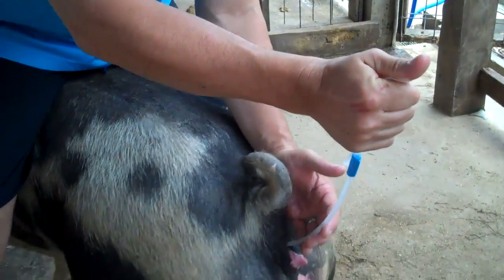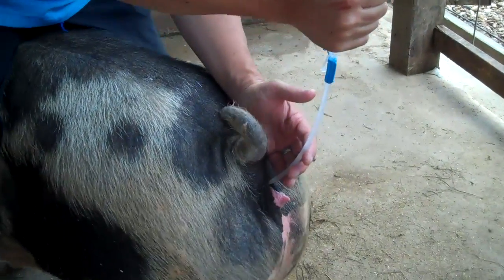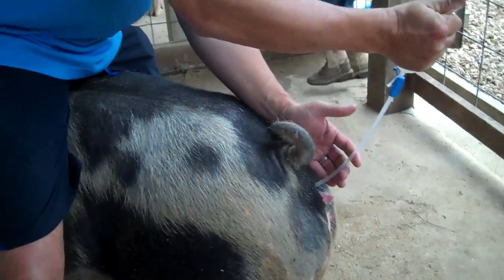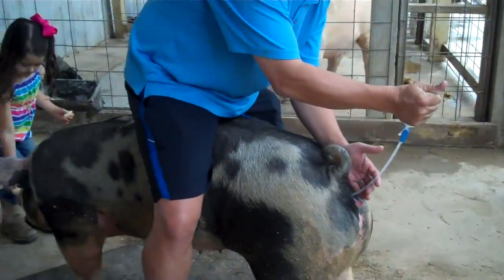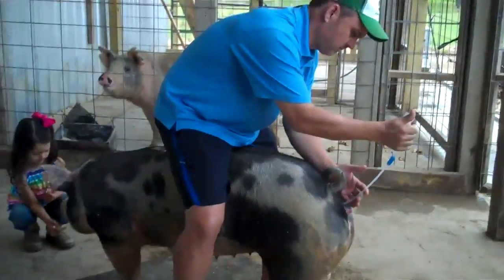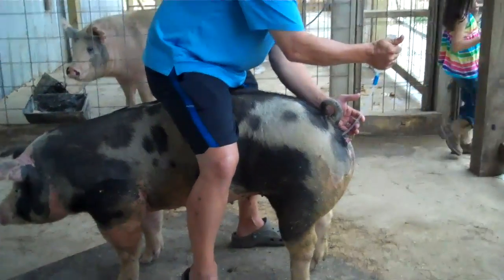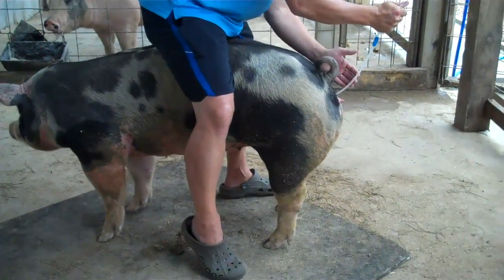Go back, watch. I want to do it. You've got to do it from back here, baby. It's fine if I'm close up, aren't I? You've got to be able to see everything — you have to be able to see the pig. Well, I zoomed in for the counter-clockwise last time.